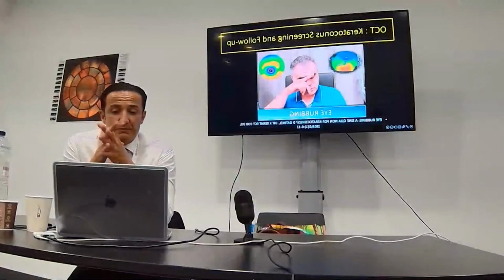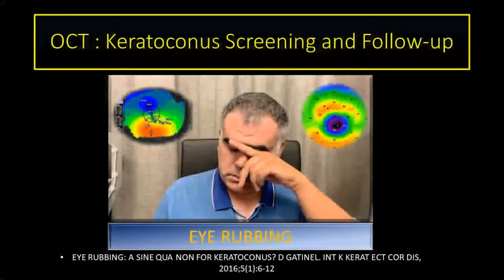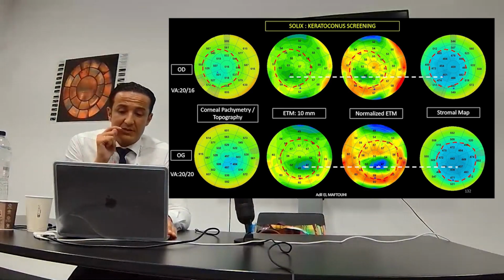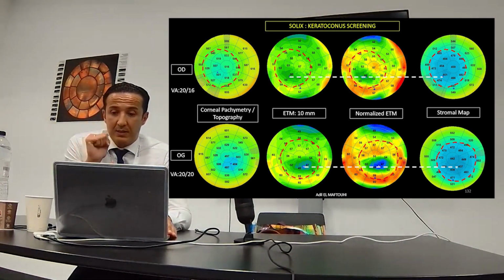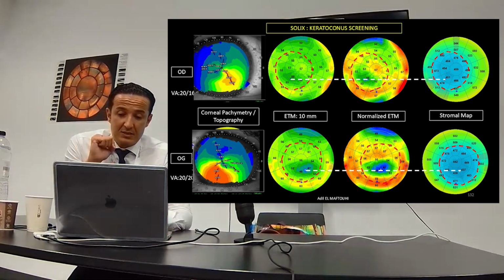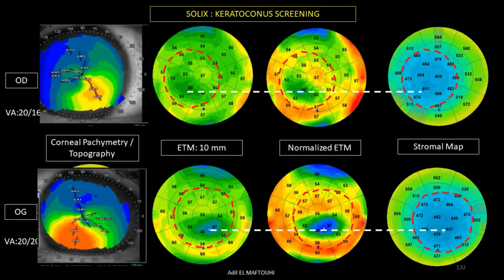And also, epithelial mapping can be useful for keratoconus screening. Dan Reinstein was the first to describe this aspect with the thinning of the epithelium above the cone, associated with a donut hyperplasia. And look here, so this shape with the thinning above the cone associated with the donut hyperplasia, and you have always to compare epithelial mapping with a stromal mapping to confirm this aspect. And look here, these changes were more pronounced on the left side, and you can confirm with the corneal topography.